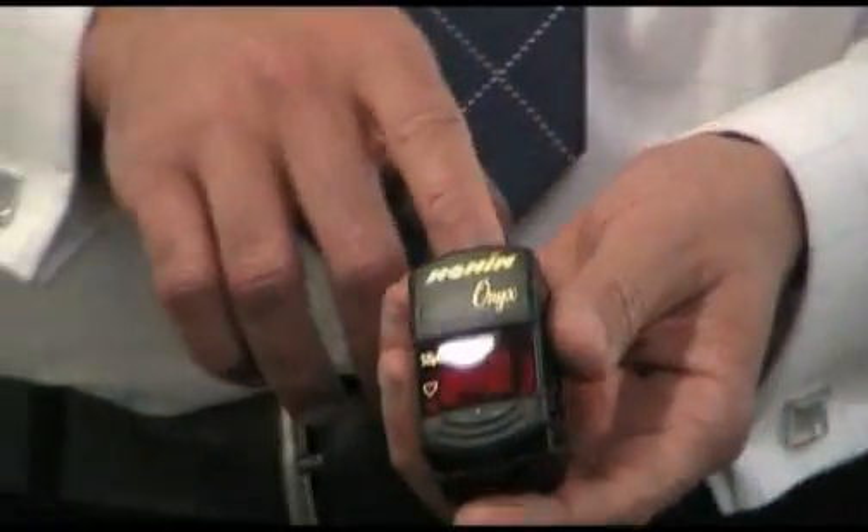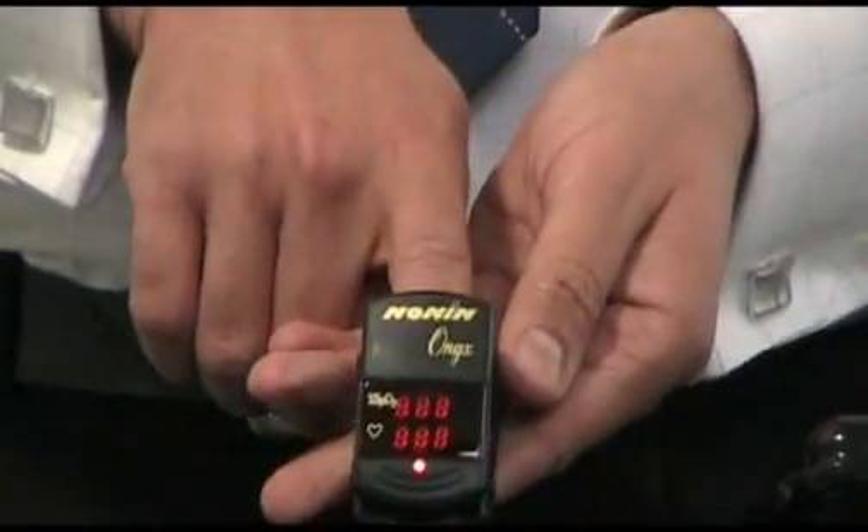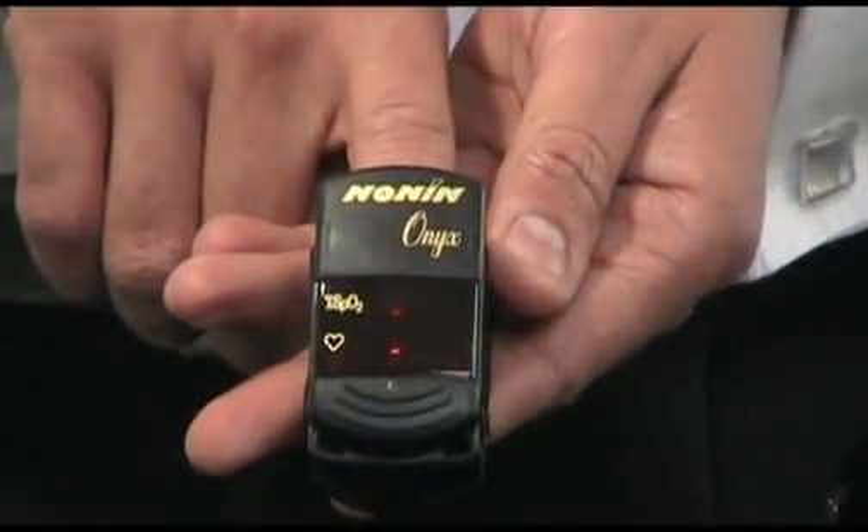To switch it on, put your finger inside the open end of the unit. It will only take a matter of seconds until a reading is displayed.